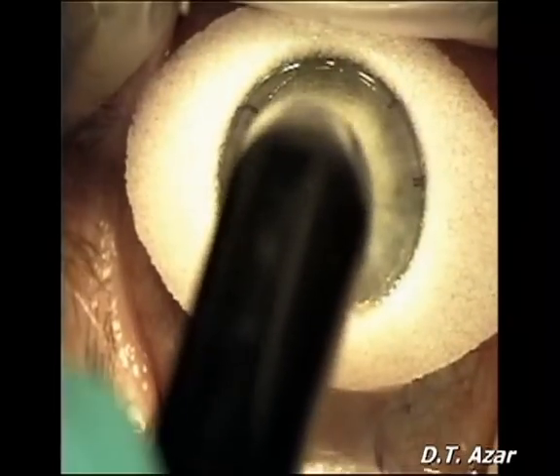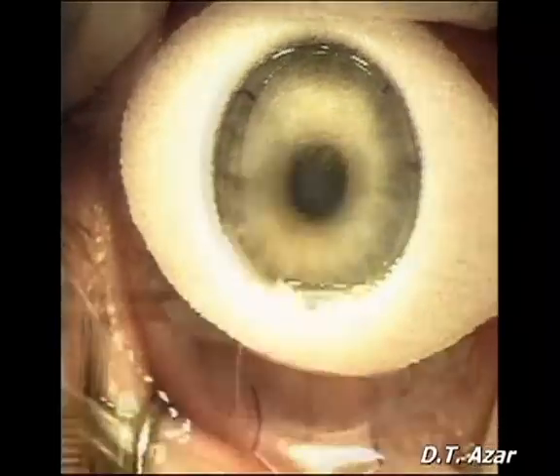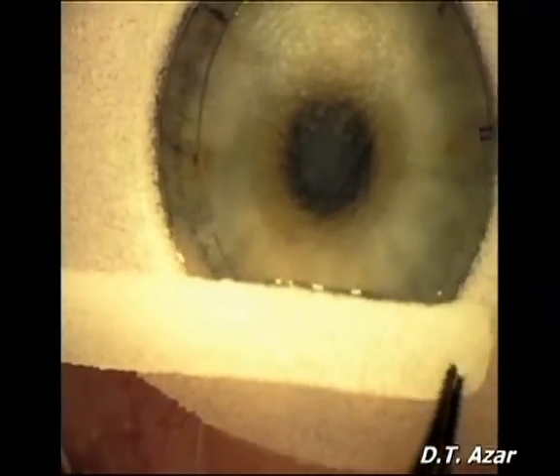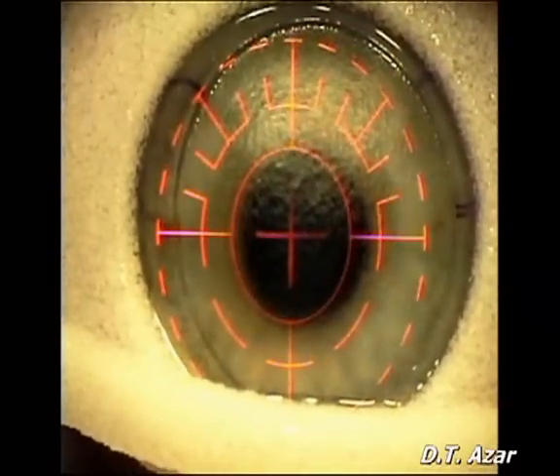The residual bed stroma is measured with ultrasonic pachymetry. A surgical sponge is placed over the flap hinge to prevent inadvertent laser ablation in the hinge.